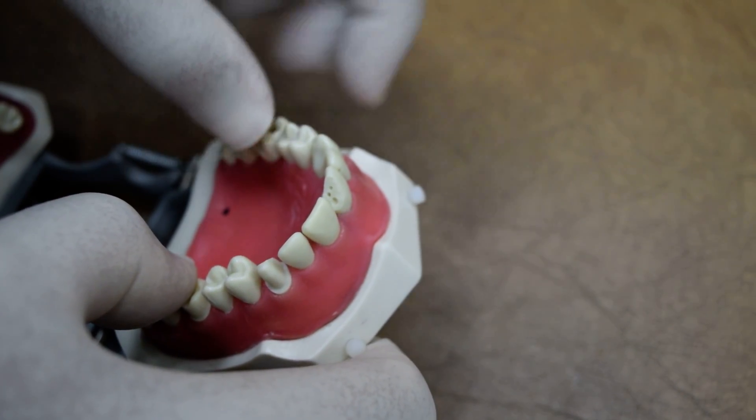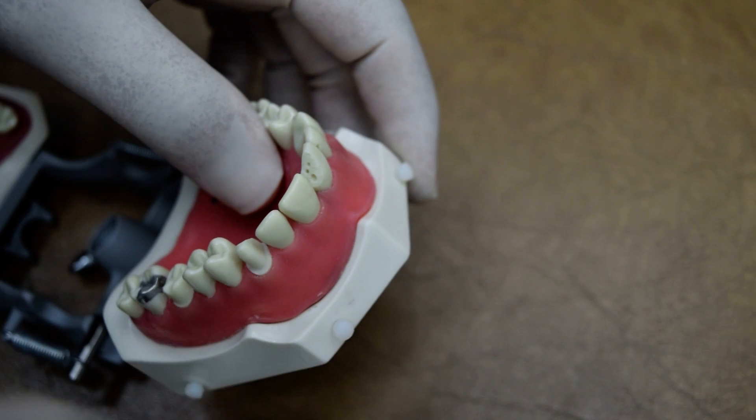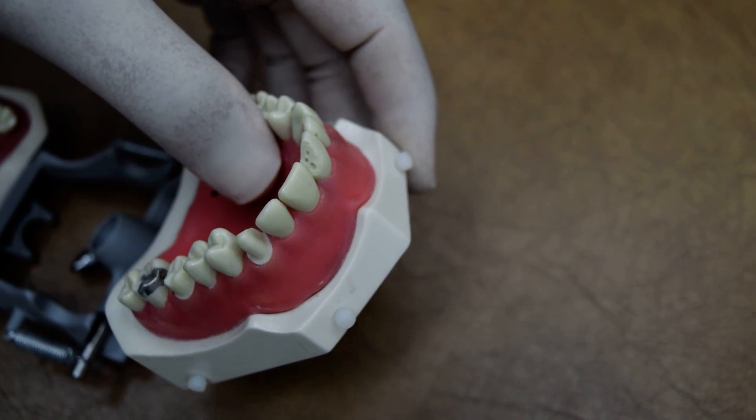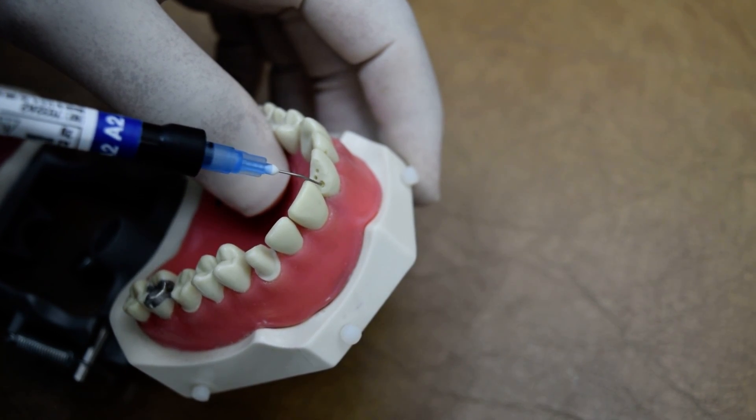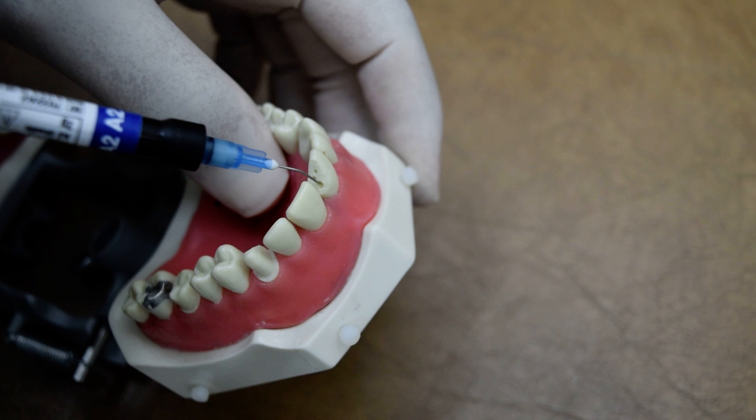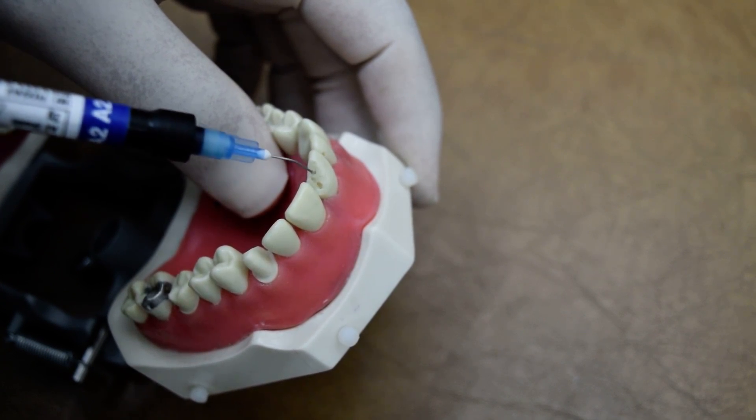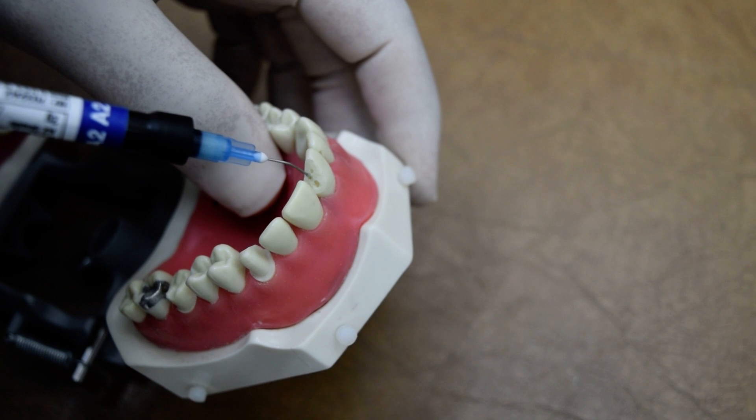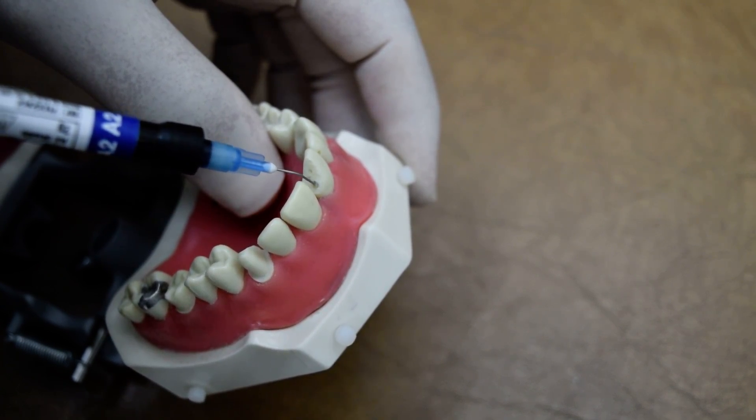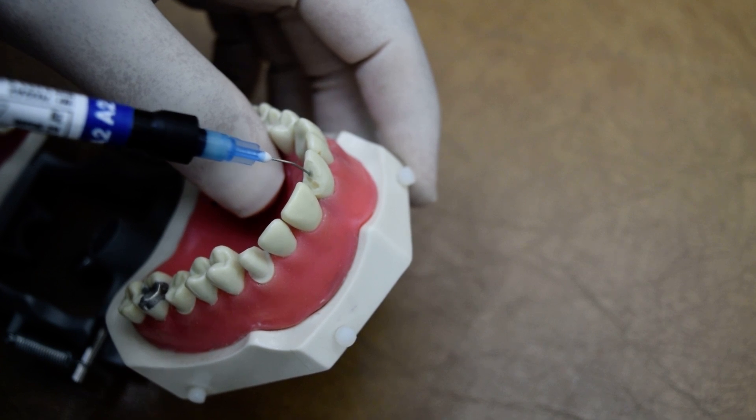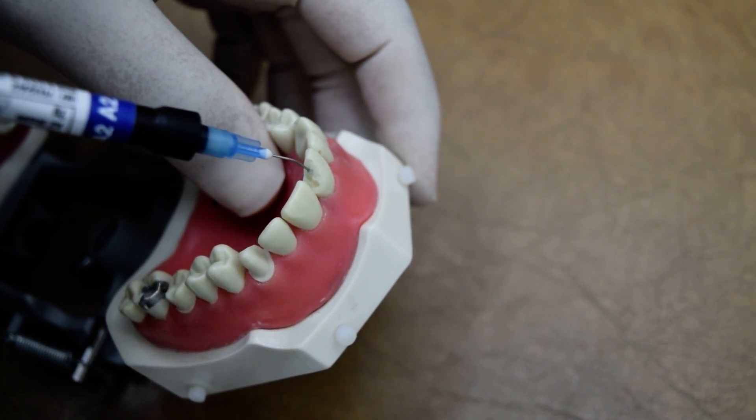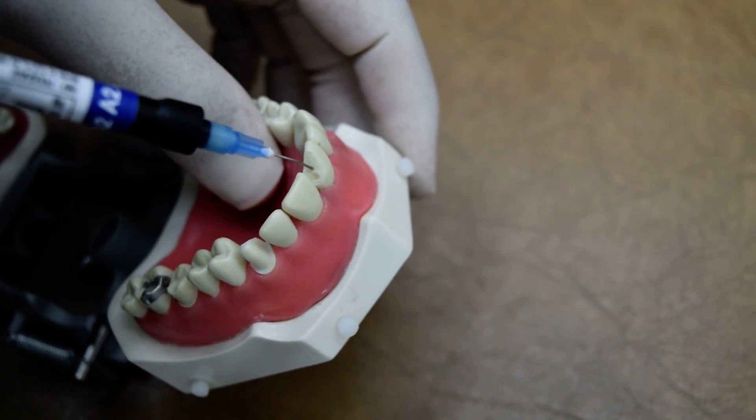And we are going to fill these grooves with flowable composite first, and it's okay to do it deep.